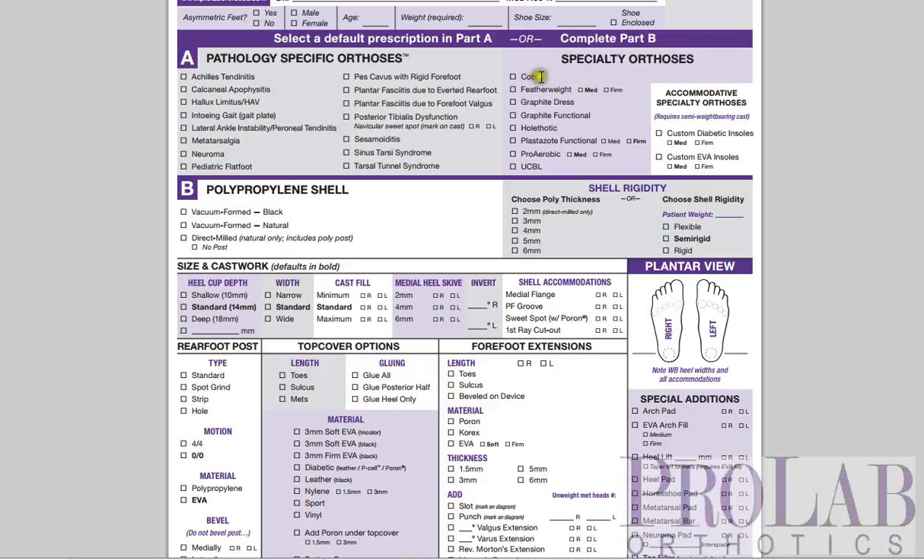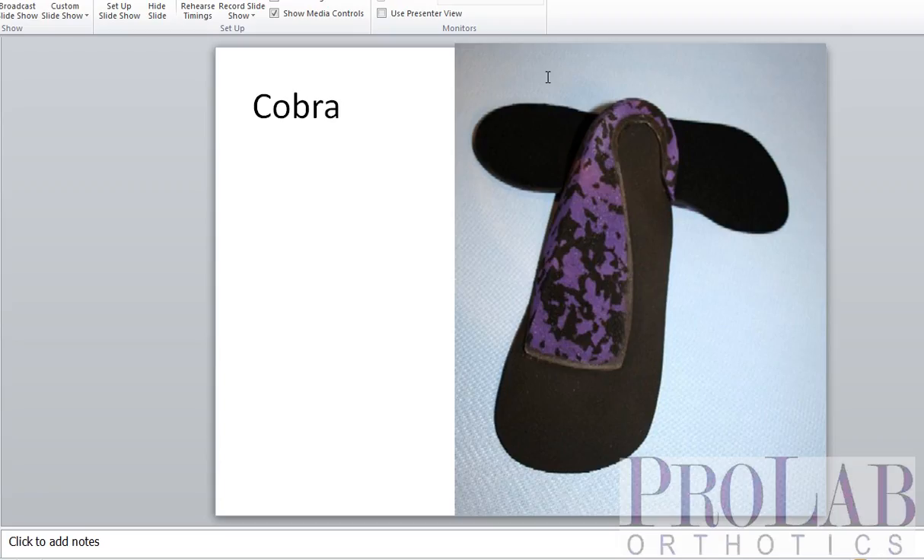The first one is the COBRA, which is a type of dress orthotic. Here's the COBRA device. You can see that it is left full thickness on the medial and cutaway on the lateral side. It has a Spenco-type or nyline cover to the toes.